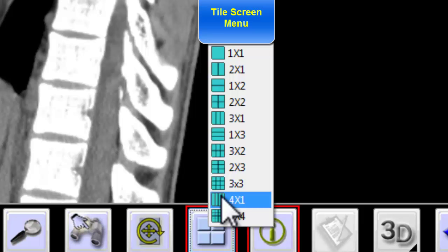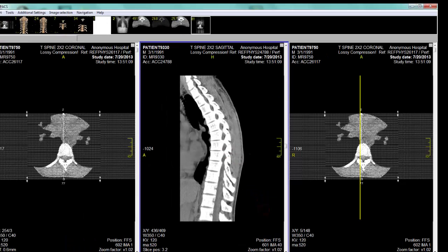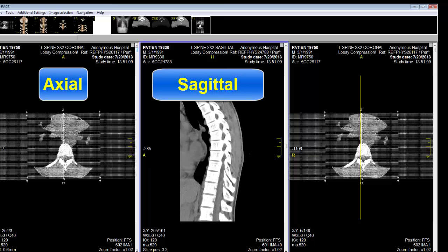I will pick a three by one arrangement. Typically, when you are learning to read two-dimensional CTs, it is best to display three tile screens in order to see axial, coronal, and sagittal sections.